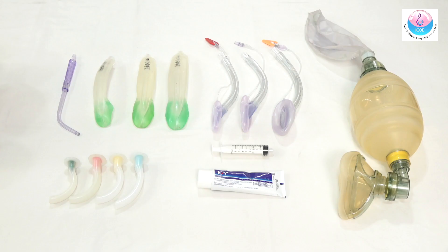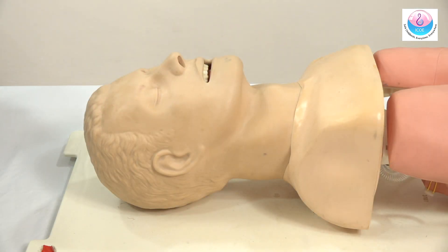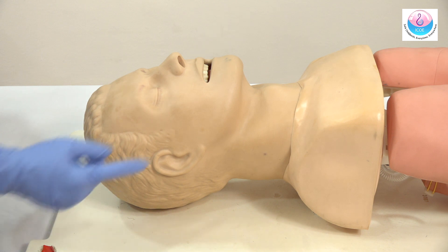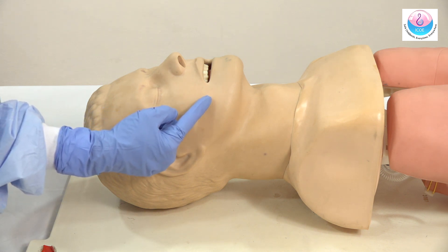In this short video, we are going to show you basic airway management in a pregnant woman. Measure the oropharyngeal airway before inserting it into the mother's mouth.